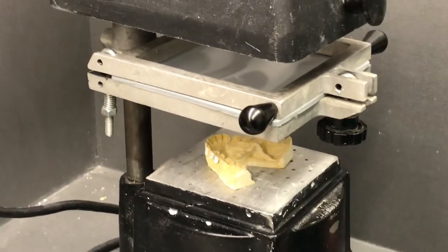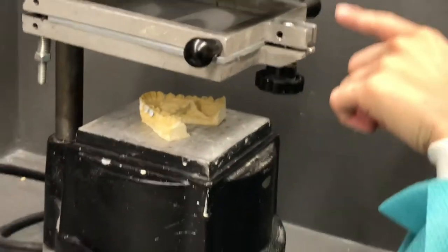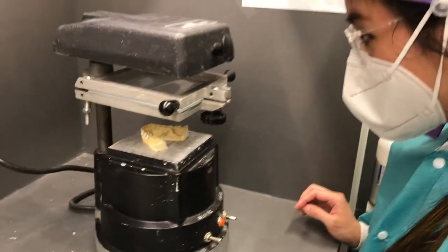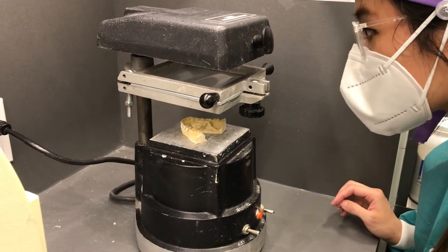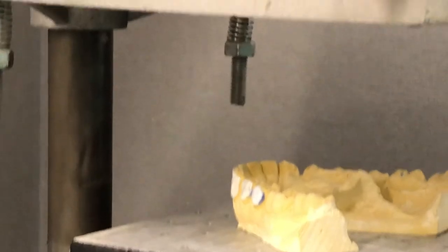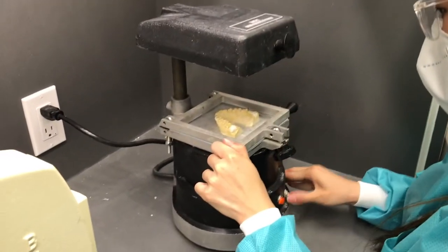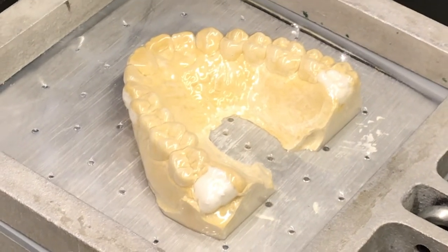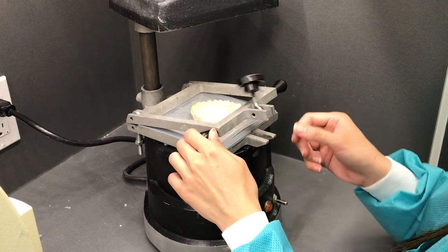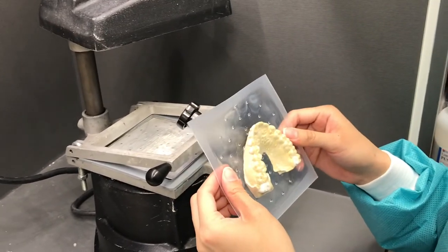Okay, we're waiting for the plastic to get heated up. And you know it's ready when it creates a little scallop, kind of makes like a U shape. See, it's almost ready. See the shape down? So that's about good. Turn this on. Off. And you just have to trim around the model.